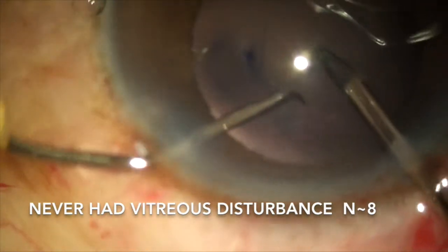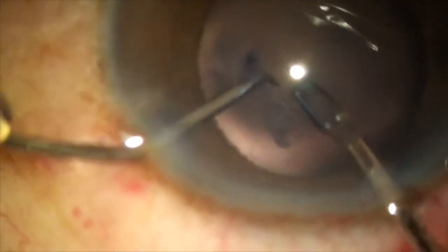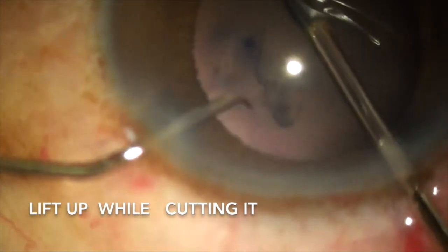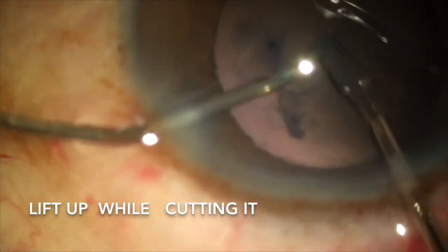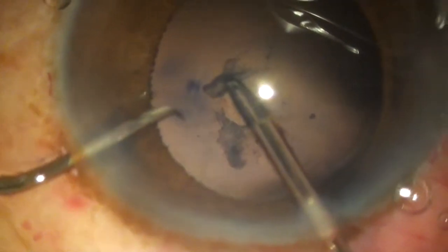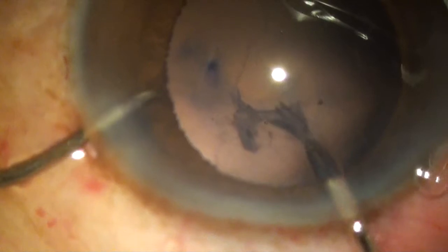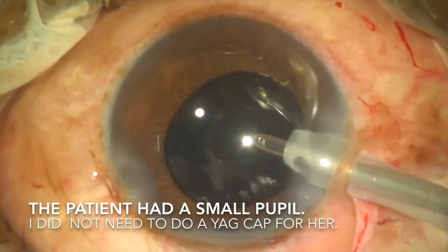In the last 3 years I have done around 8 posterior capsulorhexes when indicated and I have never lost vitreous. I believe any anterior segment surgeon can do this if he remembers to lift up the posterior capsule while cutting it, and if he remembers to make a separate convenient side port for the micro forceps and never uses the main port.